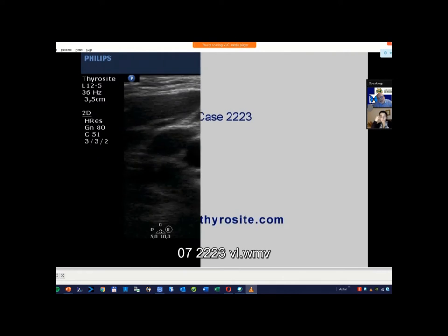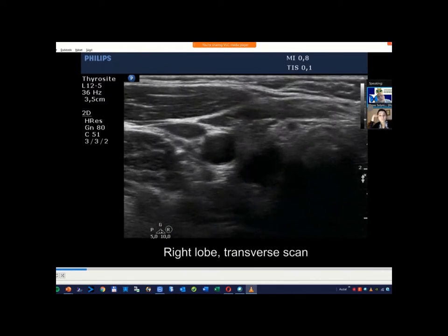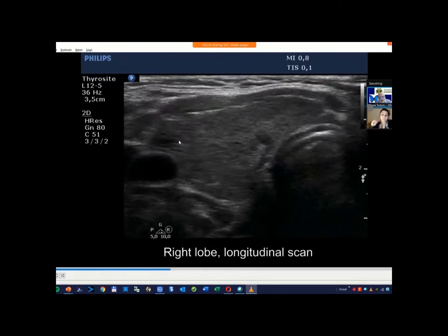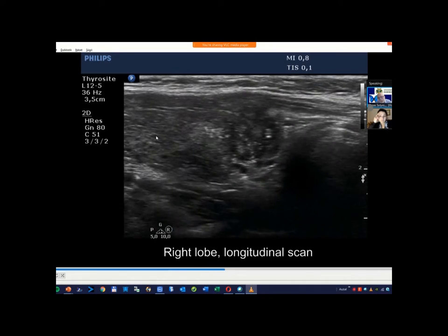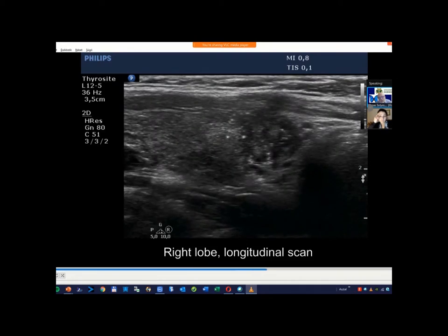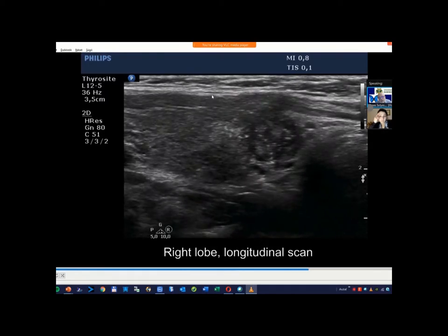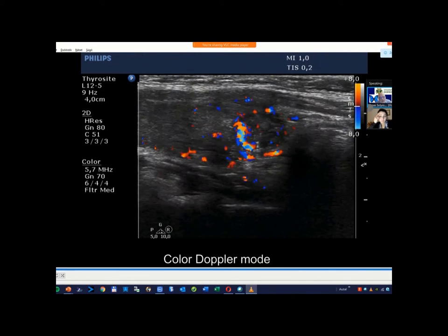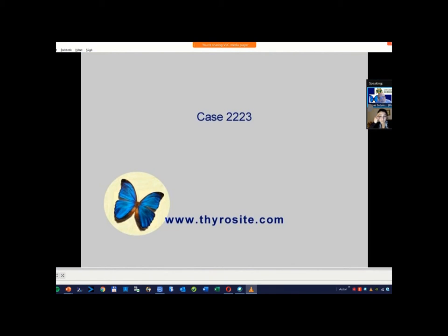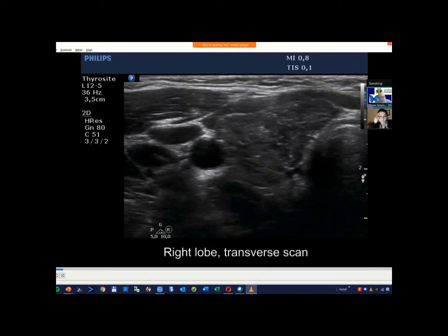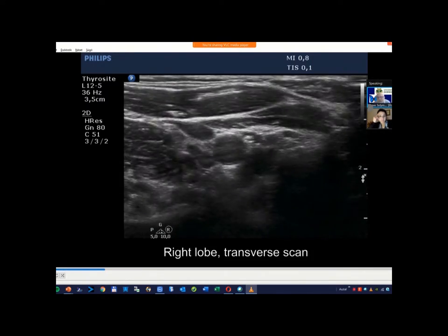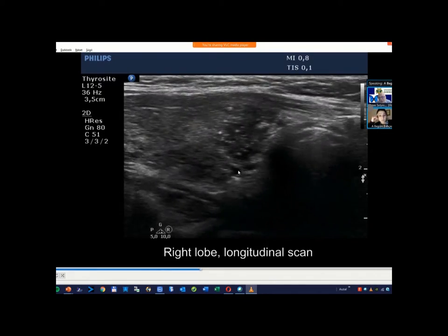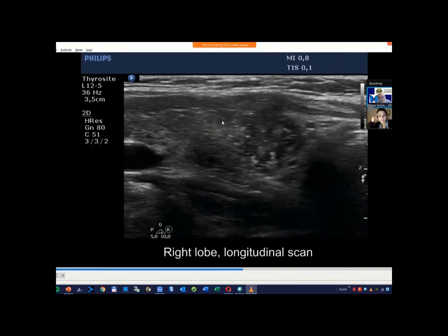This was a 9 or 10 year old girl. We have a very suspicious lesion — but otherwise, what does this girl have? Which disease? Focus on this side of the thyroid. She possibly has thyroiditis. Yes, she was a hyperthyroid girl with such suspicious nodules. I think that for an experienced ultrasonographer, this pattern is almost diagnostic of papillary cancer, so this presentation is more than suspicious.